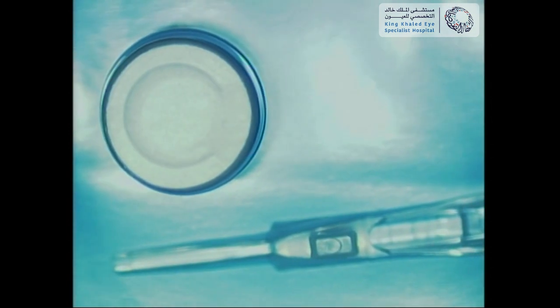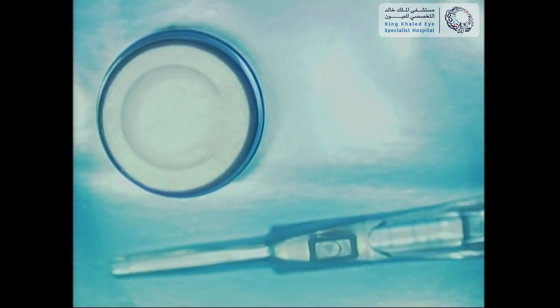This surgical video demonstrates ICL implantation in a patient with hyperopia that was not fit for other refractive procedures.